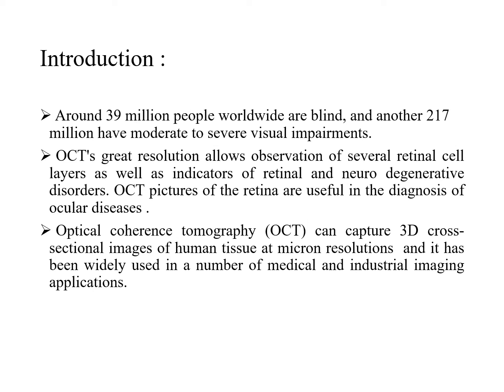Coming to the introduction part, around 39 million people worldwide are blind and another 217 million have moderate to severe visual impairments. Nearly 80% of all vision problems can be prevented or cured if the condition is detected early and treated promptly. Optical coherence tomography can capture 3D cross-sectional images of human tissue at micron resolutions, and it has been widely used in a number of medical and industrial imaging applications.